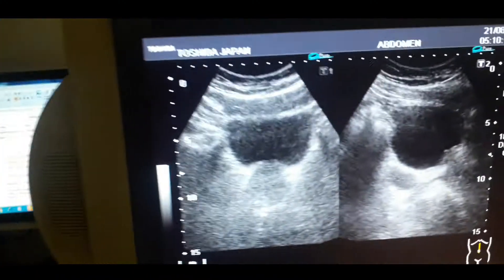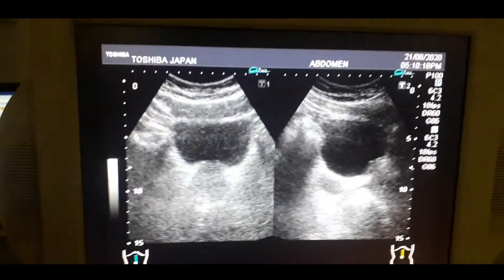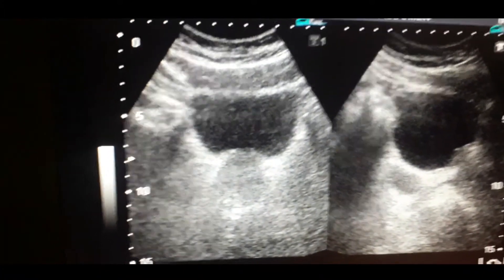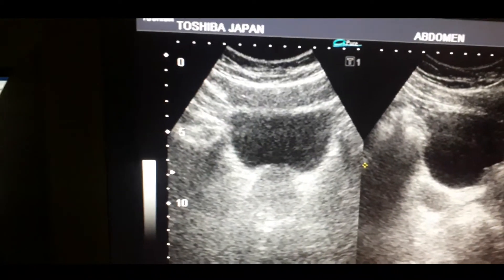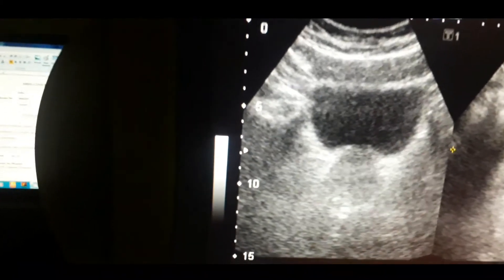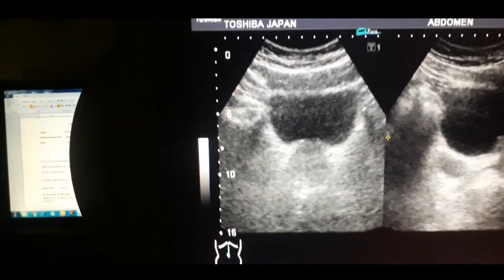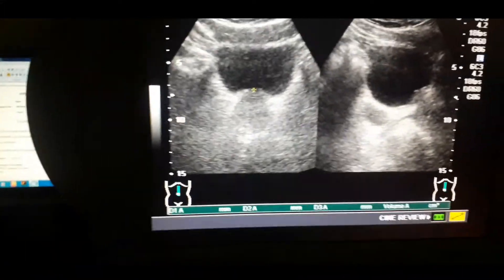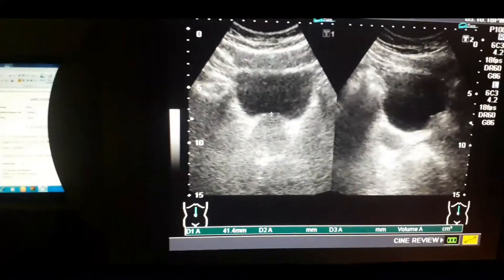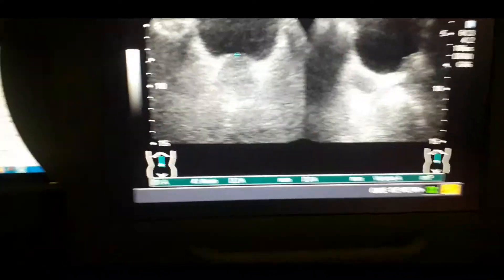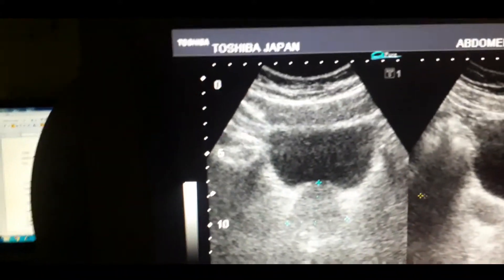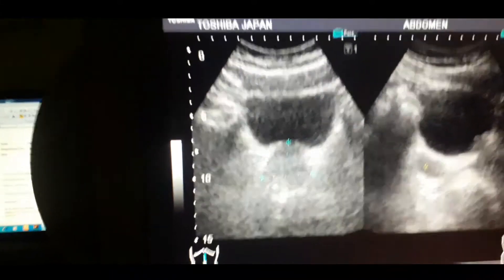So this is the live case. I have focused the prostate with the bladder filled. Below you can see the prostate. We have to measure the size of the prostate to calculate its weight. We measure the prostate in three directions: transverse, longitudinal, and anterior-posterior. This shows the weight of the prostate — it is about 43 grams.